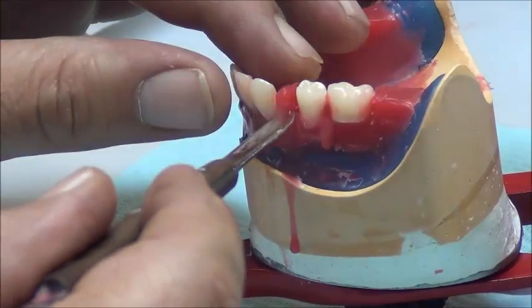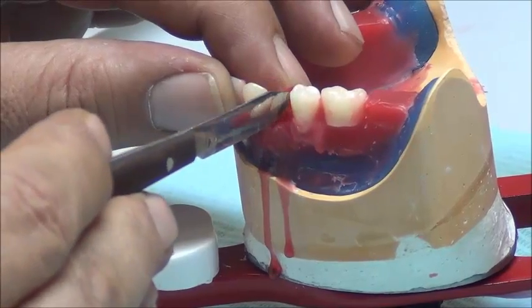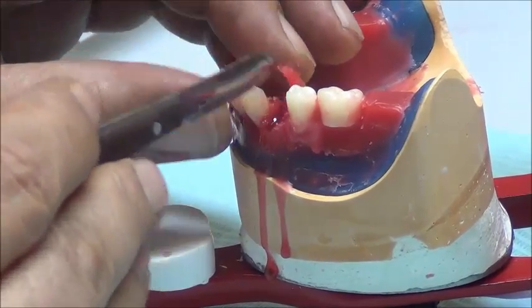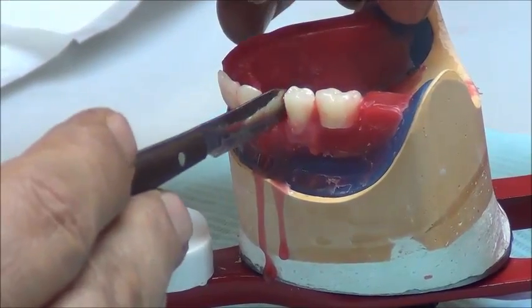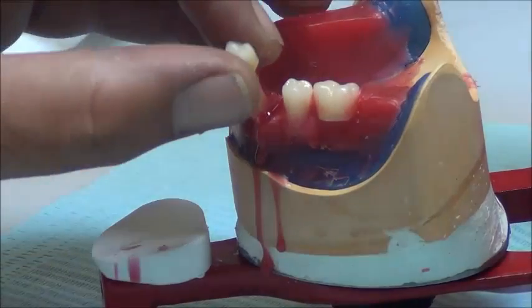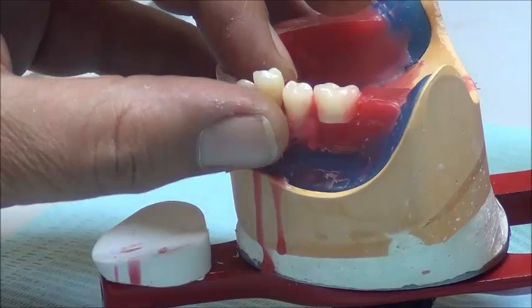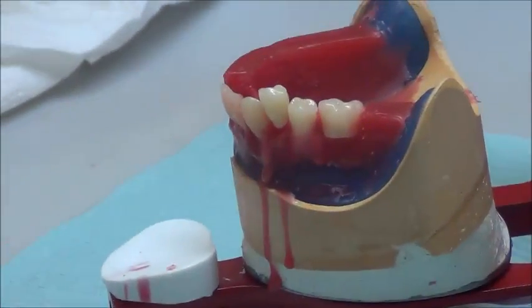So first we remove the wax for tooth number 4, which is the lower premolar. And we try to put it, we find that it doesn't have any place.